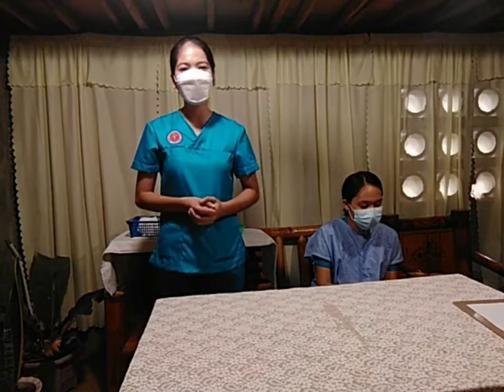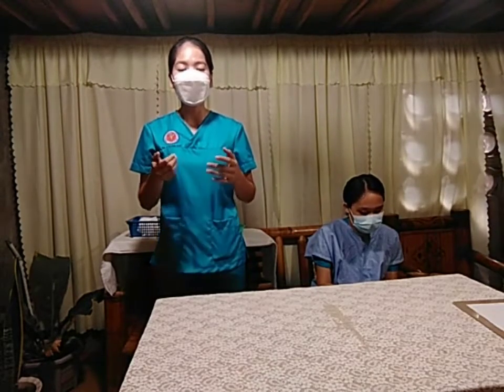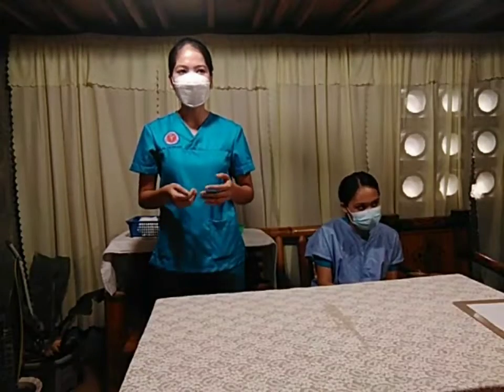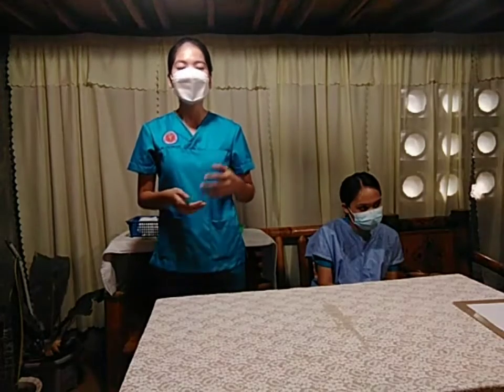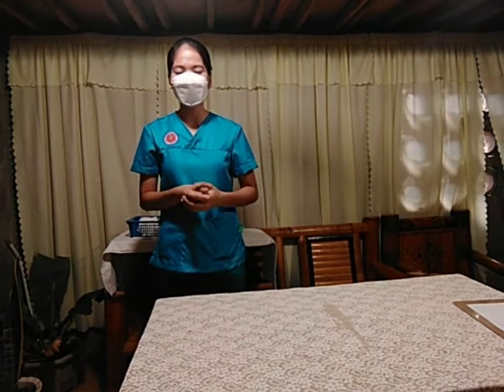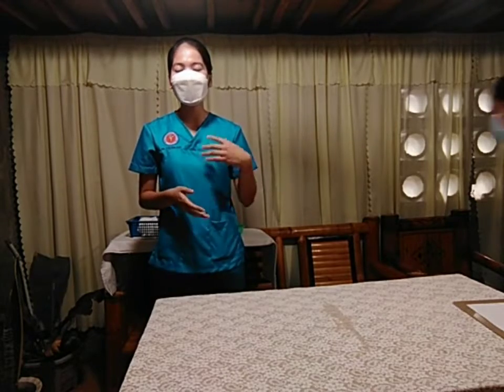For today's return demonstration, I'm going to perform the administering of nasal instillation. Before doing the procedure, I'm going to state the types and the purpose of nasal instillation. First, we have the decongestant. This is for rhinitis and sinusitis, and an example is saline drops.